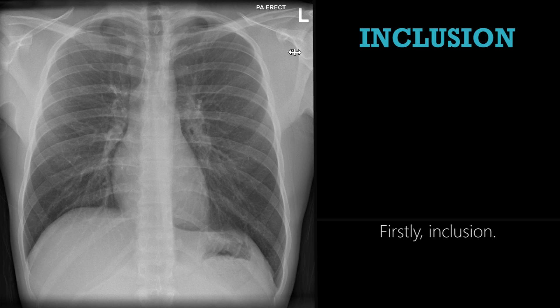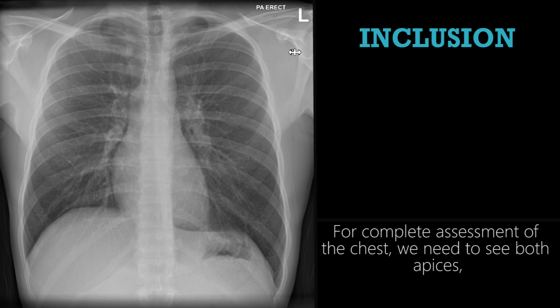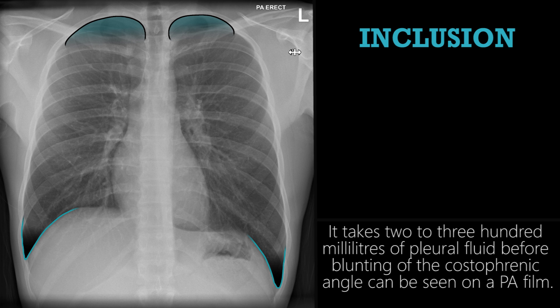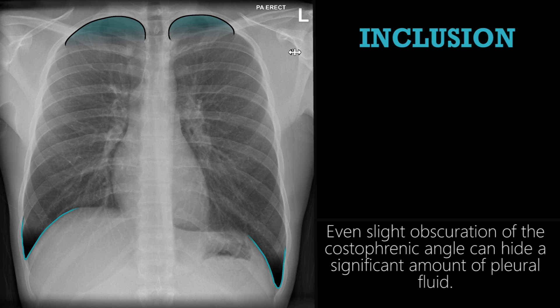Firstly, inclusion. For complete assessment of the chest, we need to see both apices and both costophrenic angles. It takes two to three hundred milliliters of pleural fluid before blunting of the costophrenic angle can be seen on a PA film. Even slight obscuration of the costophrenic angle can hide a significant amount of pleural fluid.